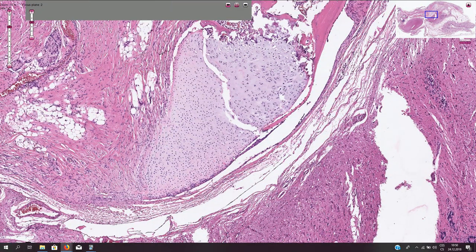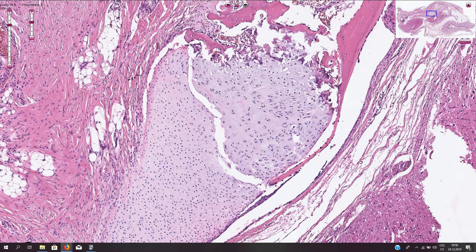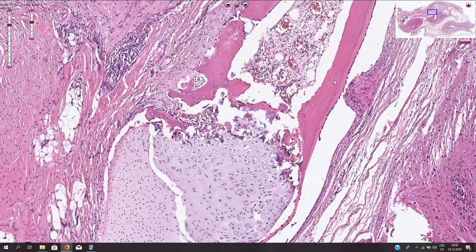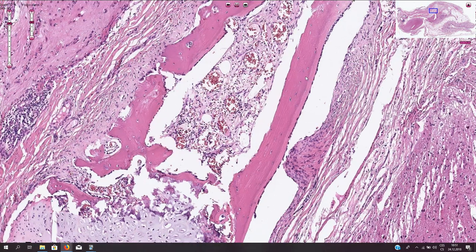Here we have something that looks like cartilage with lacunar cells. And if we go further, here we see bone tissue, and in between the cartilage and mature bone we have an area of enchondral ossification. So this is the process of bone formation as we see it in the normal body. Here we have mature lamellar bone with osteocytes inside and osteoblasts on the periphery.